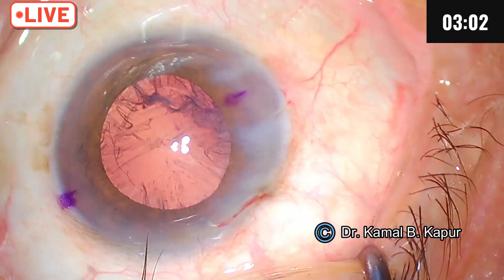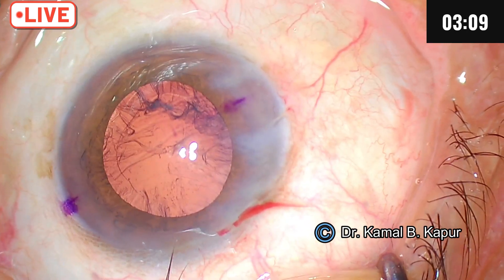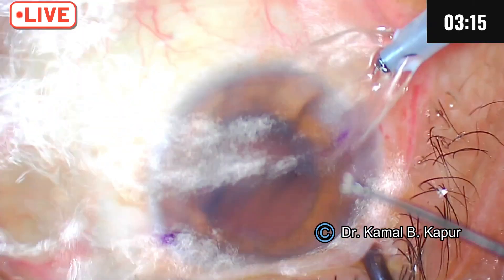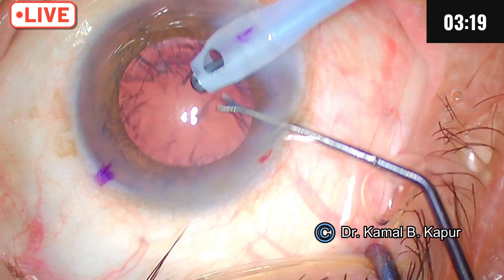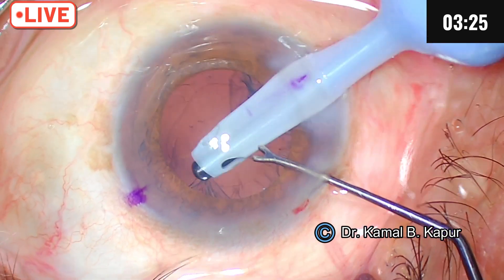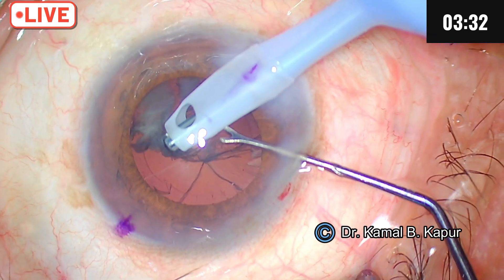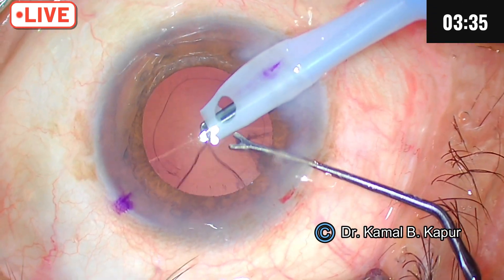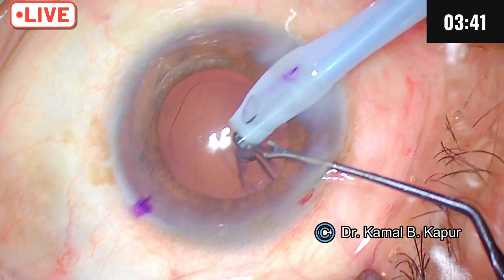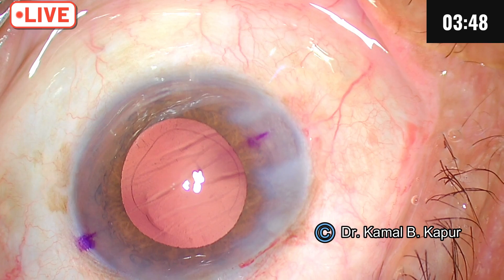After the surgery we will reduce the astigmatism by approximately 0.7. I do the simplest method of reducing astigmatism in these cases by doing an OCCI. Whenever my astigmatism is 1, 0.8, 0.9, or 0.75, I employ the OCCI — it works great. Even for multifocal or EDOF patients who have a mild astigmatism of 1.25 to 1.3, doing an OCCI — the opposite clear corneal incision — works wonderfully. In my study I have been able to reduce astigmatism by approximately 0.75 to 0.8 very comfortably.